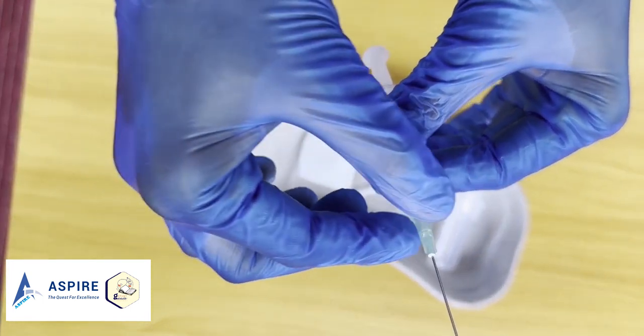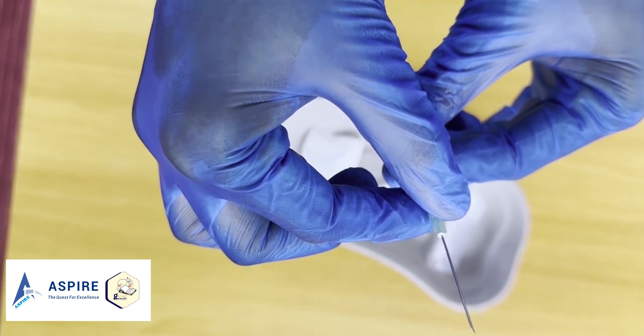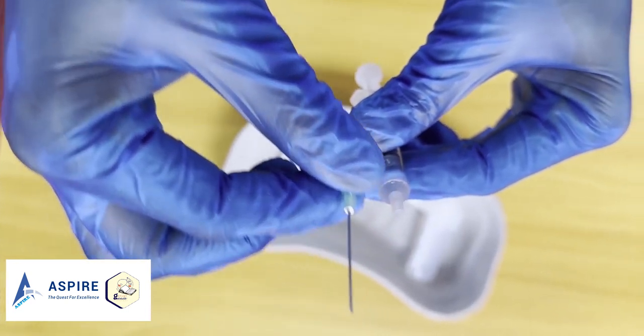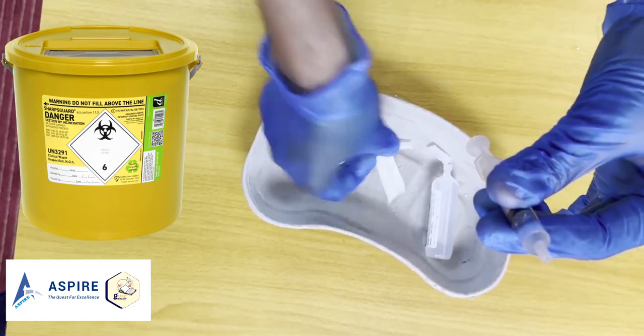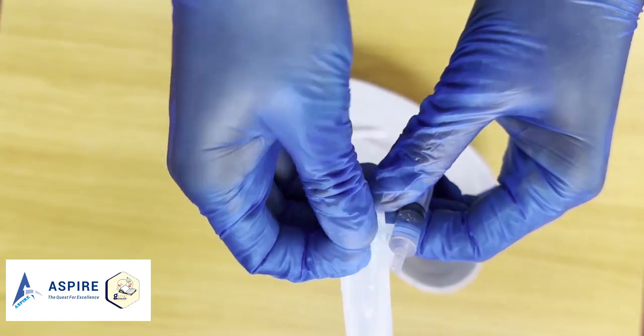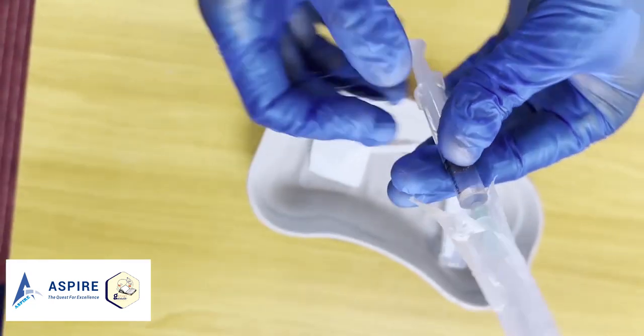Make sure the drawing-up needle is different from the one you're going to inject with. Take it out and dispose of it in the sharps bin — the yellow bin.